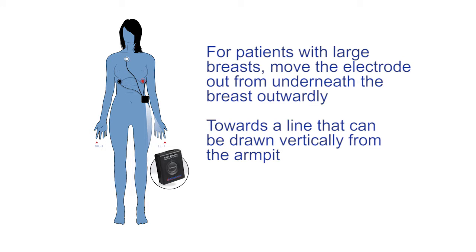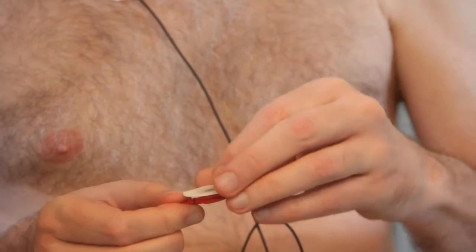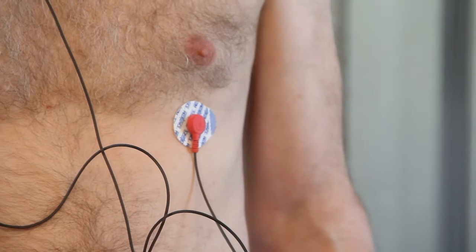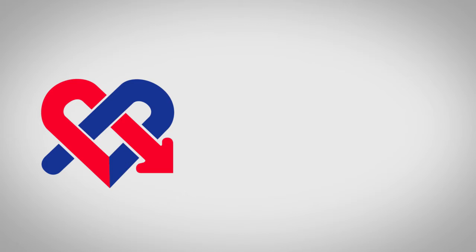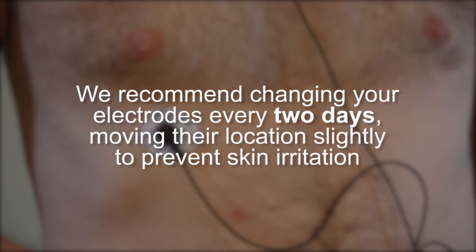For those with large breasts, move the electrode out from underneath the breast more outwardly towards a line that can be drawn vertically from the armpit. Finally, take the wire from the red terminal and snap it onto one of the electrode patches. Peel it from the plastic backing and apply it to the lower left, opposite the black one, in the same position as the black but on the opposite side. We recommend that you change your electrodes every two days, moving their location slightly to prevent skin irritation.